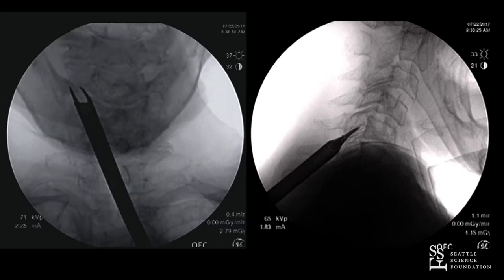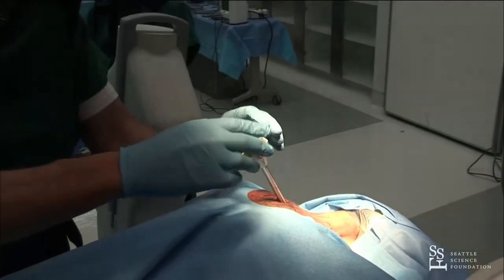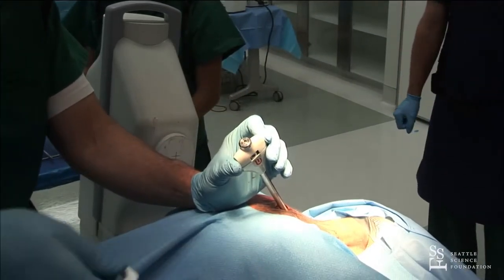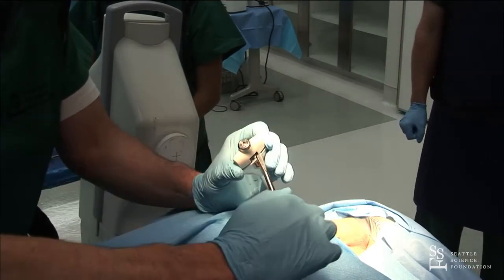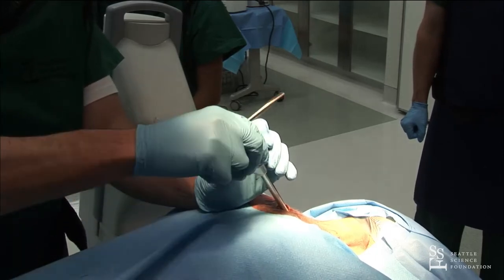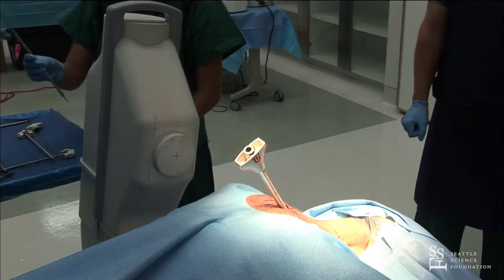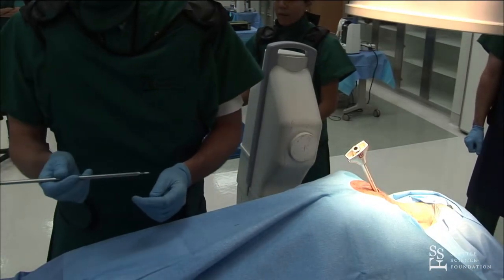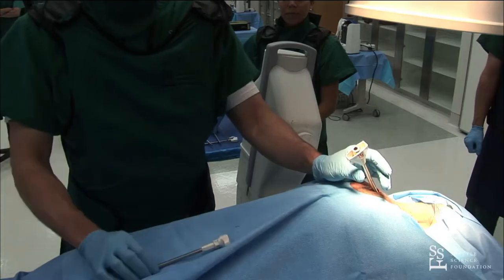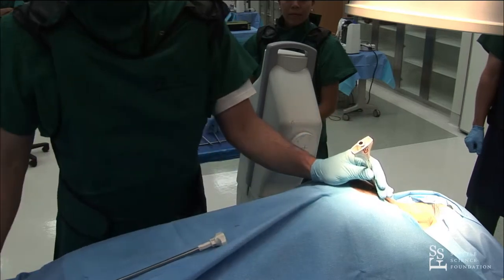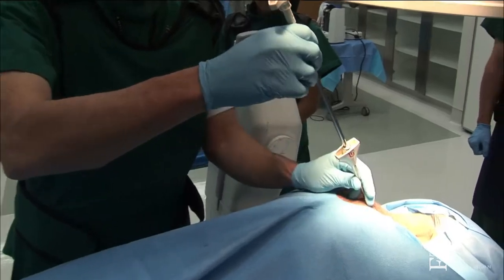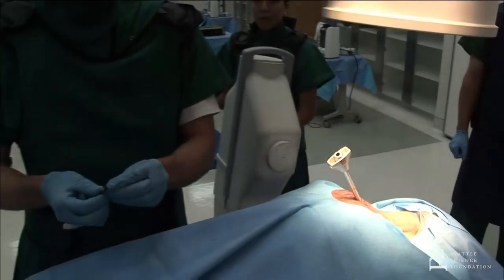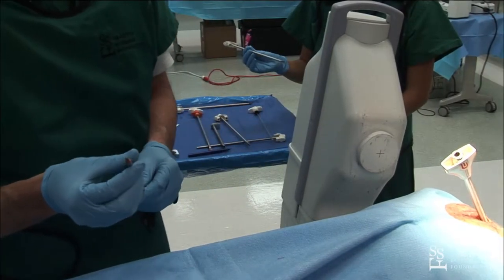And then through that tool, I place various rasps and decorticators to remove the cartilage. So here I'm just removing the cartilage out of the joint. Typically I take about five or six passes. We have a rotatory decorticator which is a little more aggressive — I can do five or six passes with that. This is the rotatory decorticator; it's a little more aggressive if you don't feel you're getting enough. Back down a little bit, which is easily correctable — I just tap myself back in. Then the rotatory decorticator goes into the joint, and you can see I'm getting a lot of bone bits and shards. I've got good decortication of the facet cartilage.